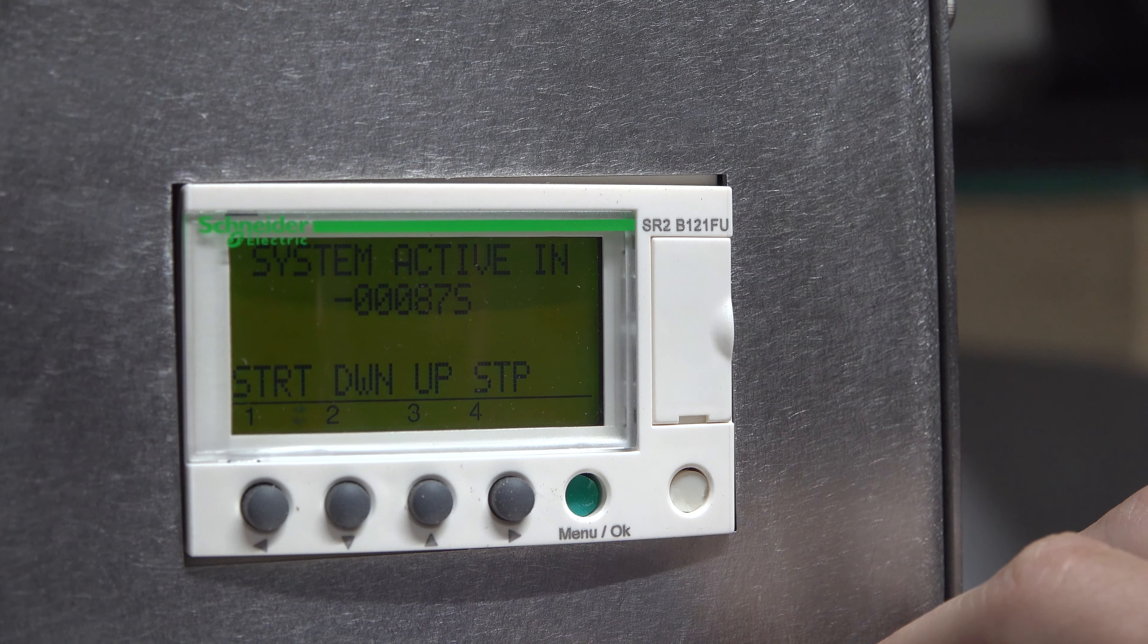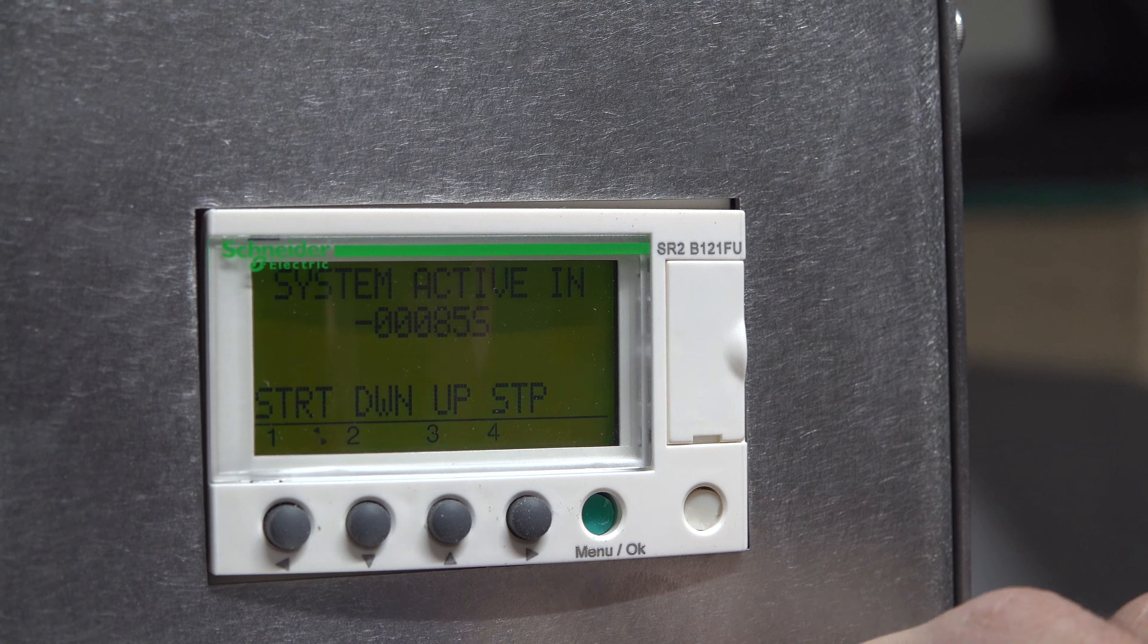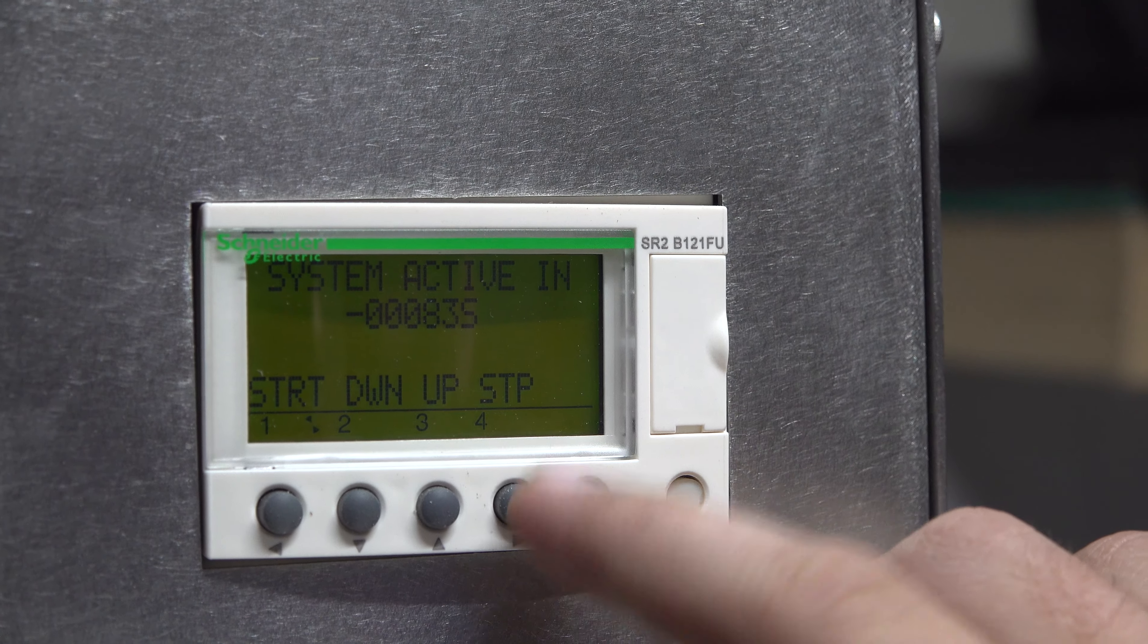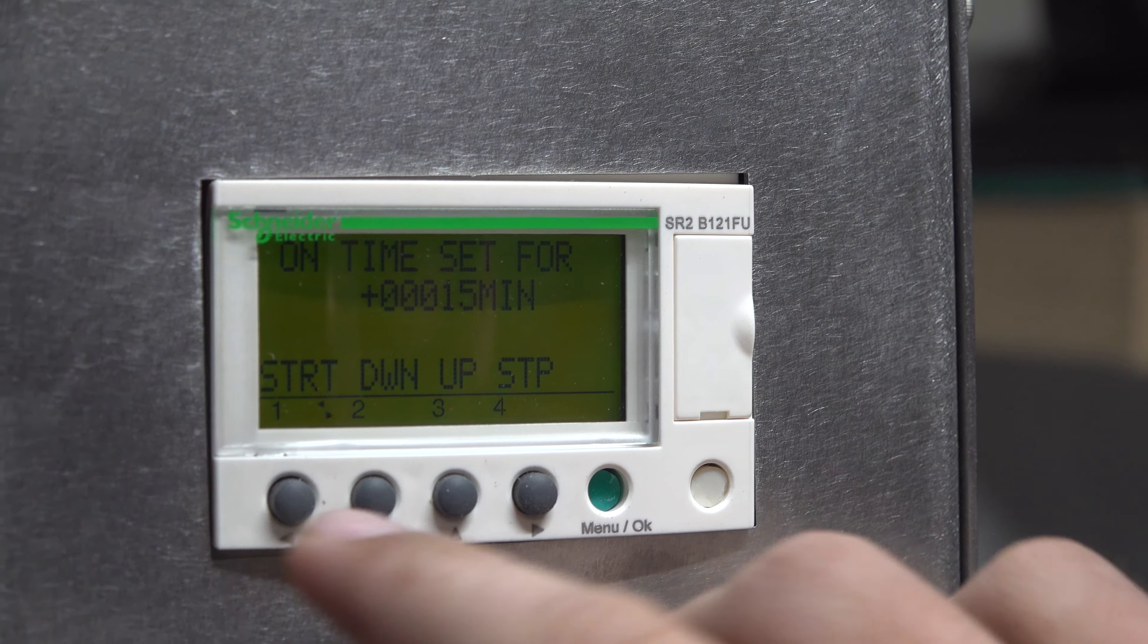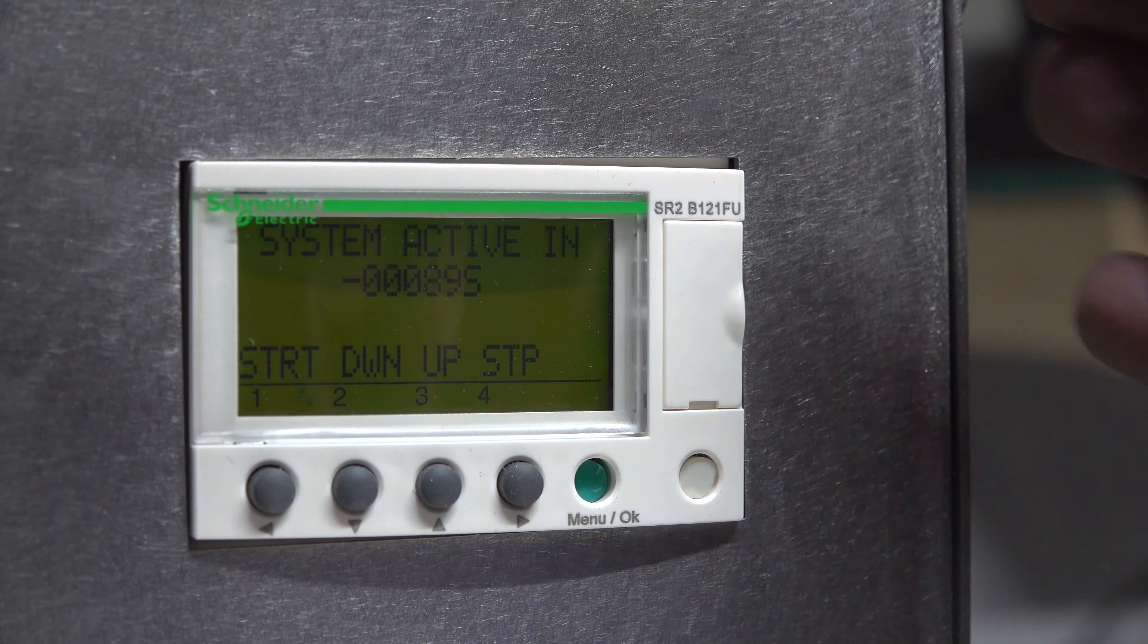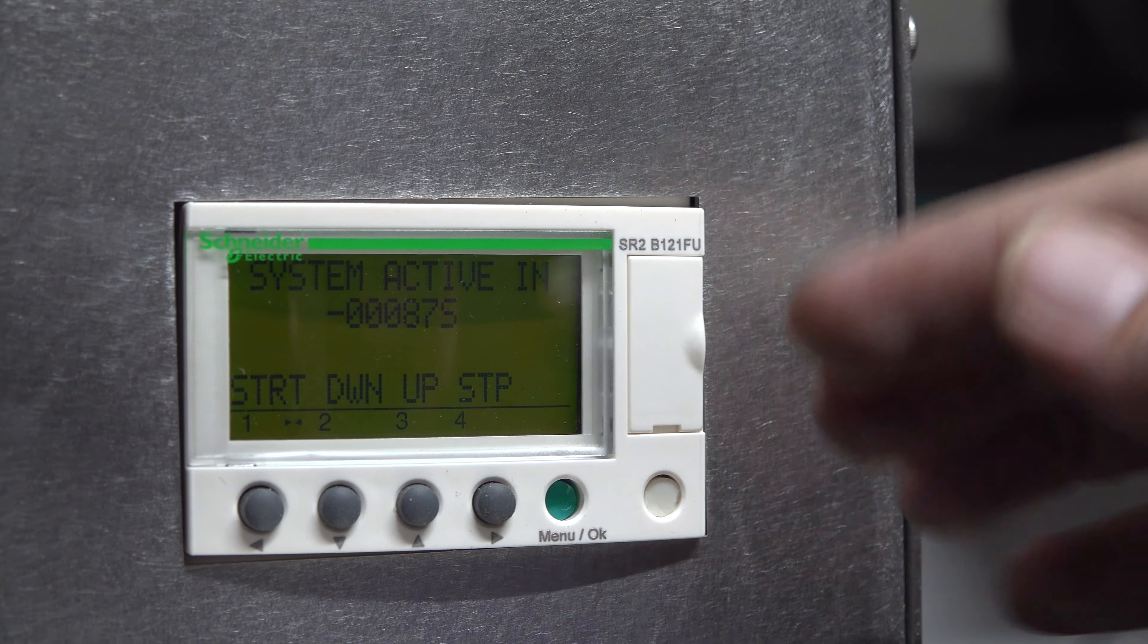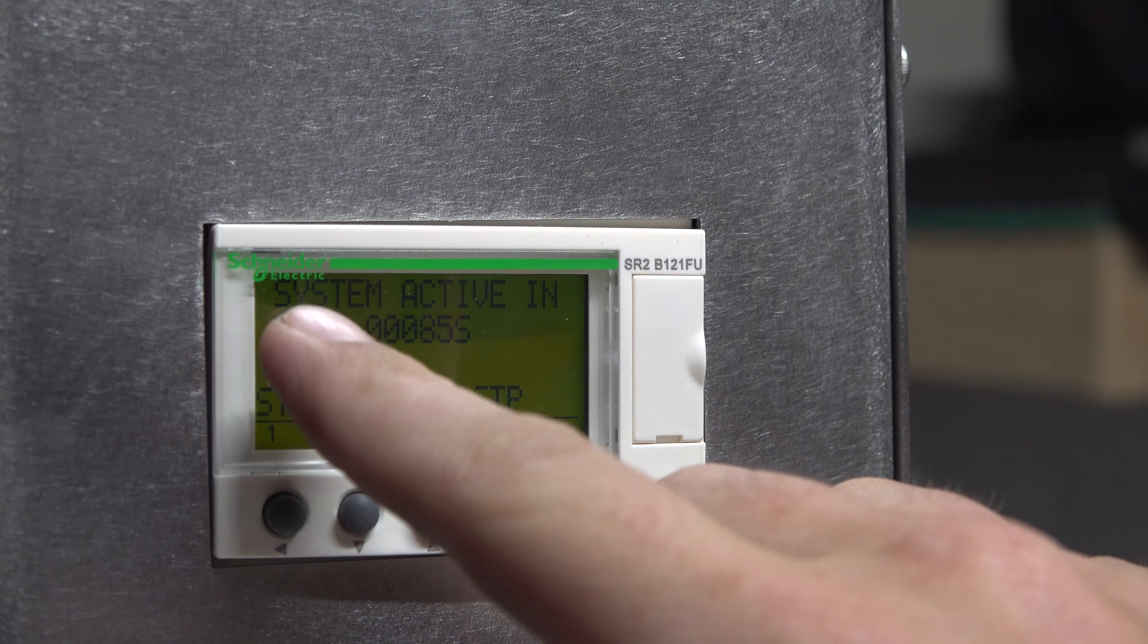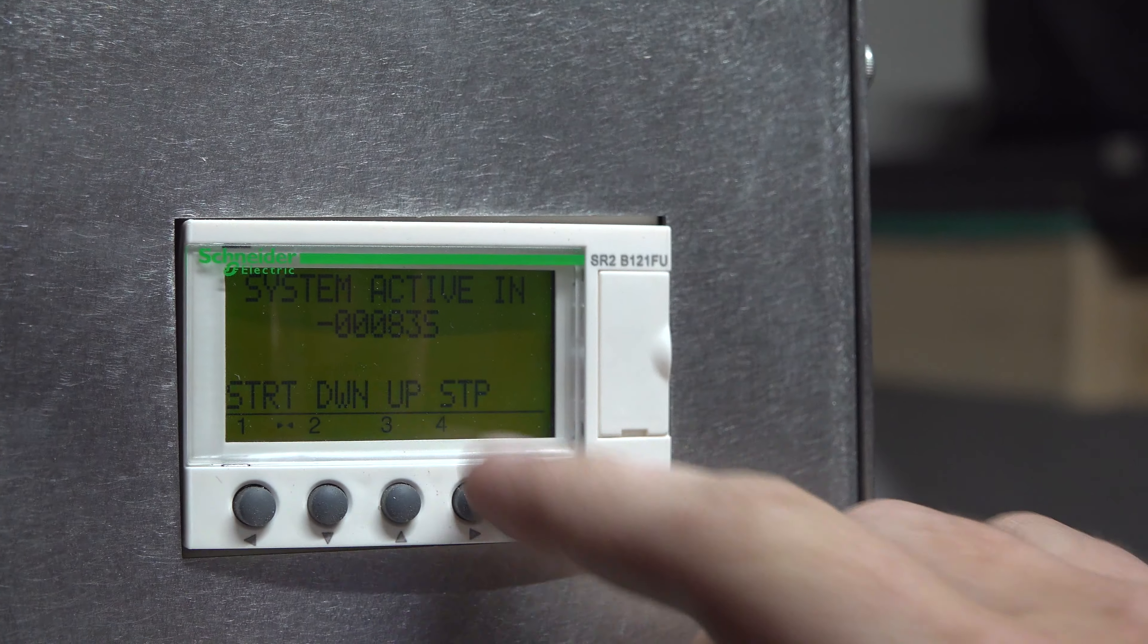If you wish to stop that at any time, you can just press stop. Otherwise, let it time out. Once the system activates, you'll see the message say 'system active.'